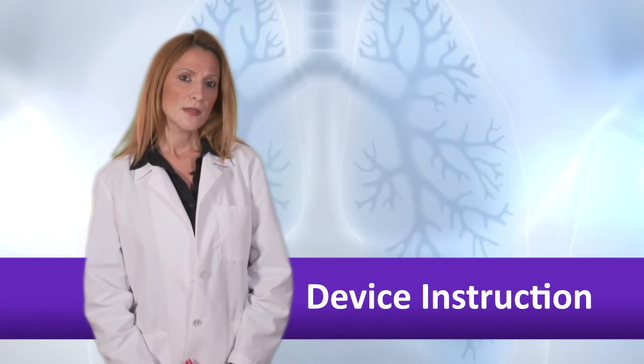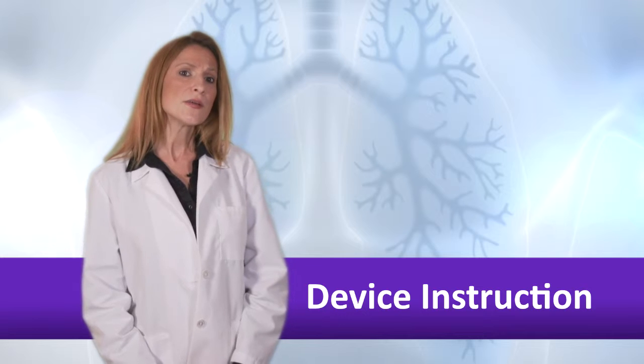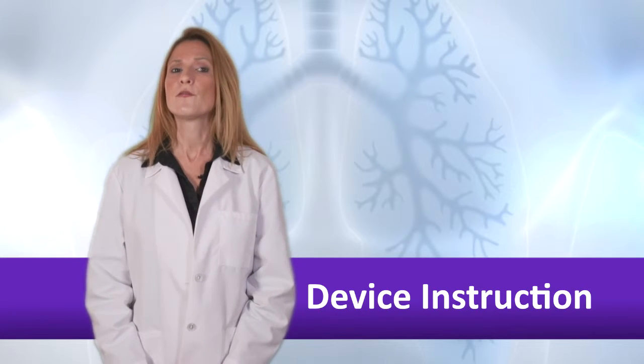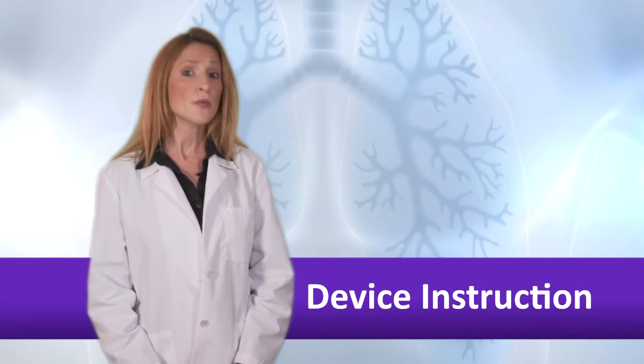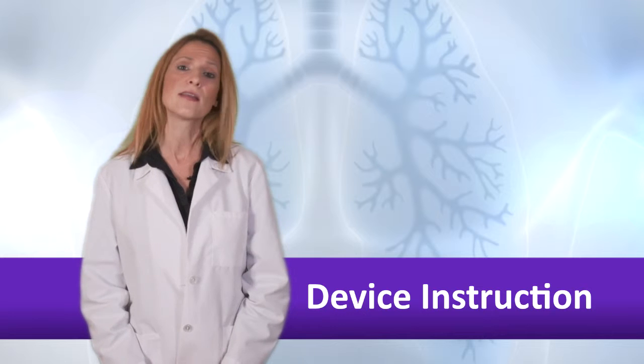For example, the speed of your breath was really good this time. Notice we didn't hear the whistle on the holding chamber. But remember, it is important to hold your breath for a full 10 seconds if you can. Please try one more time. I will count with my fingers with you to help you see how long that is.